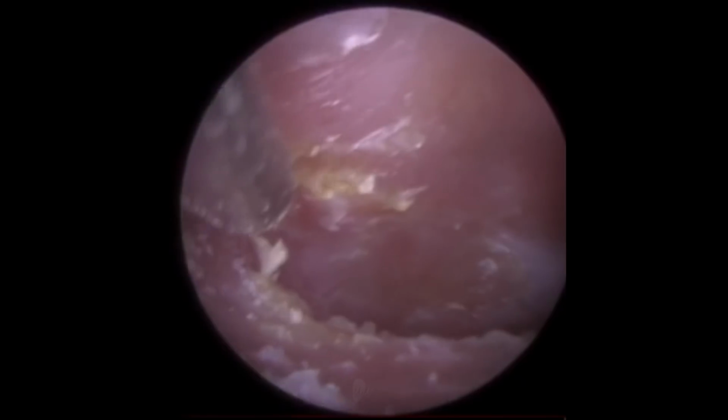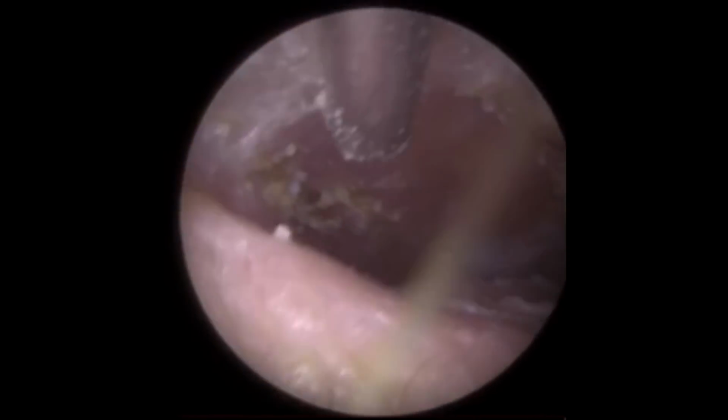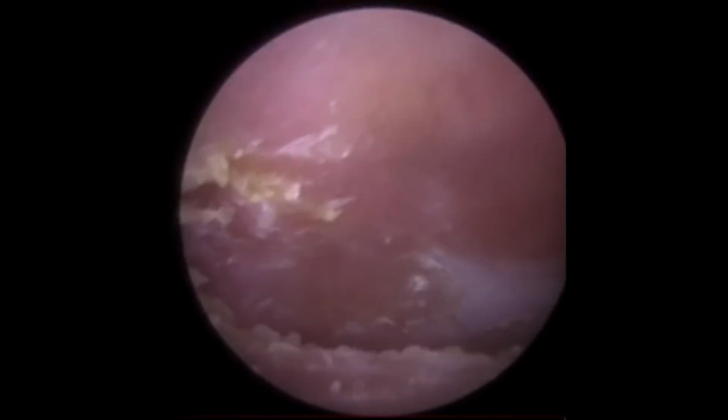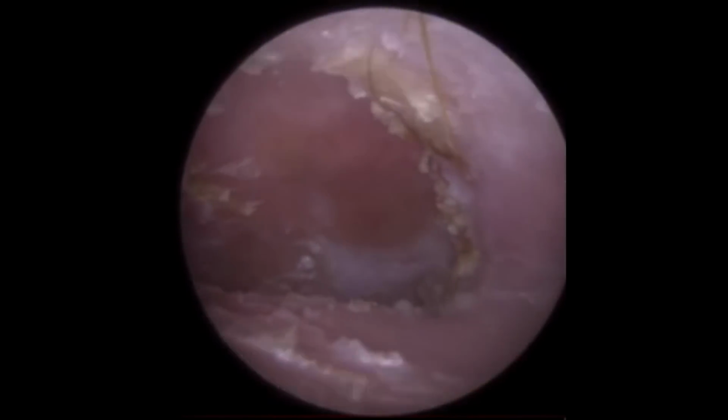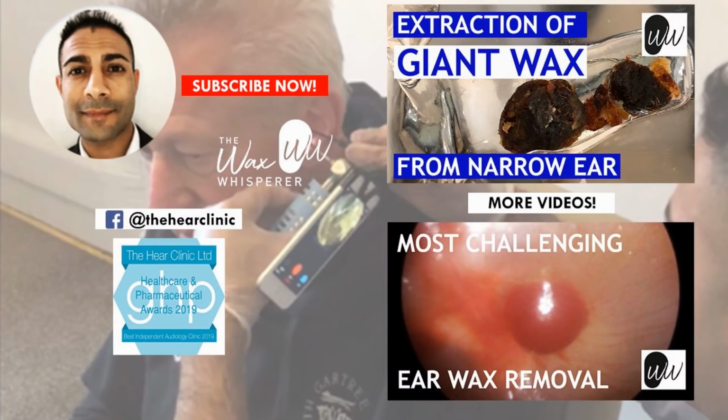So yes, for this patient, when we did tympanometry, a lot of the sound that we amplified into the ear bounced back out of the ear. We detected that, which tells us that his middle ear is not performing well and it's got fluid behind the eardrum. So that was the procedure complete.